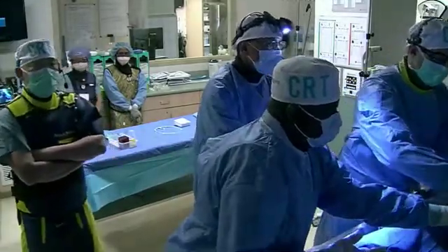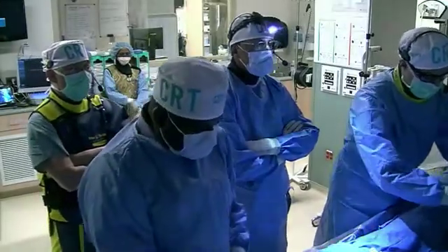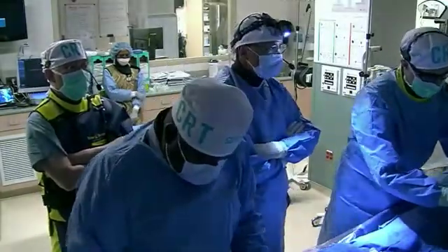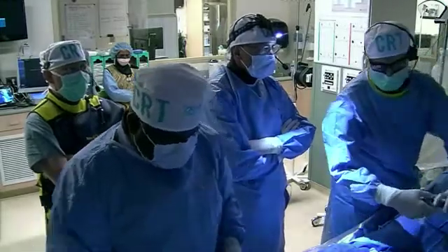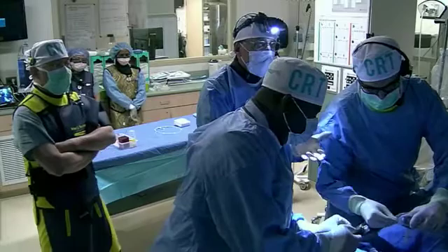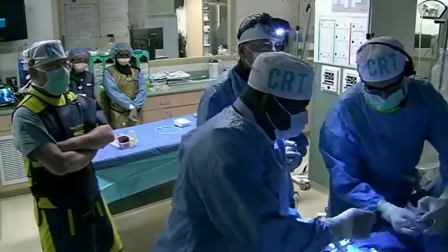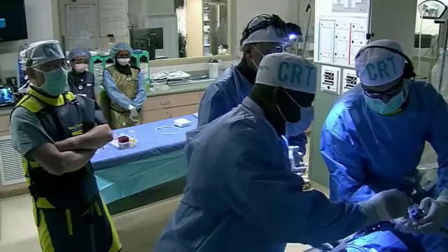You know, Lowell, if that were me, I might have just taken the NC balloon. That might have been your approach too. That's what I just said personally, dilated. Yeah, I agree. But we can try. We're going to do it. So we'll use the concept of just using the shockwave balloon at pressure and see what happens. And I think that's a good test.